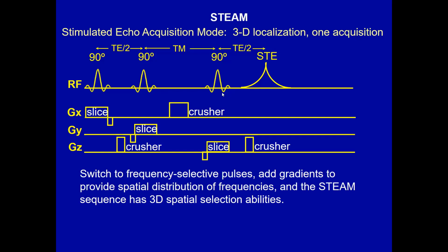To put that in practice, it's just a little more complicated than I talked about a moment ago. Here are the slice selection gradients. Slice for say X, slice for Y, and a slice for Z, each with a frequency selected shaped pulse. The one complication here is, see this thing? Just like was the case for the imaging, when we do a slice selection for an image, we have to put a refocusing lobe on the gradient, because here the magnetization is tipped into the XY plane, but only after that can we turn off the slice selection gradient.